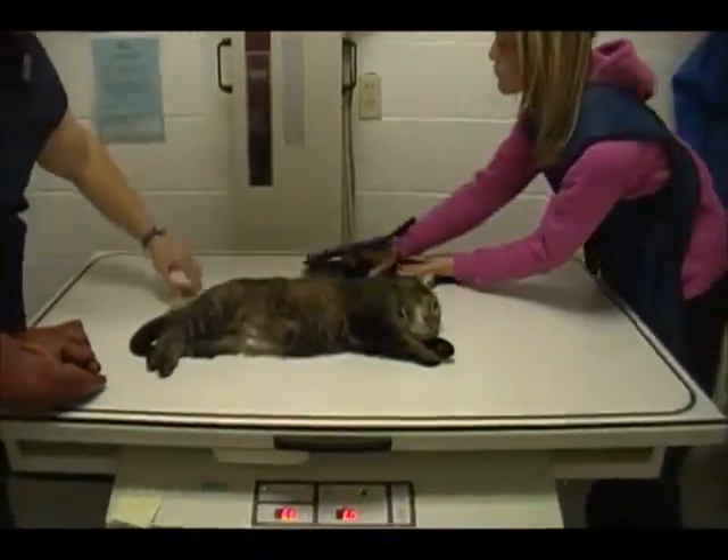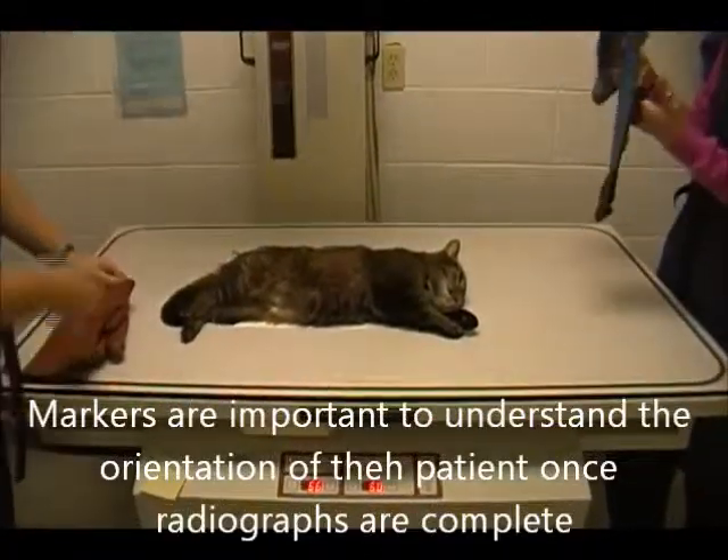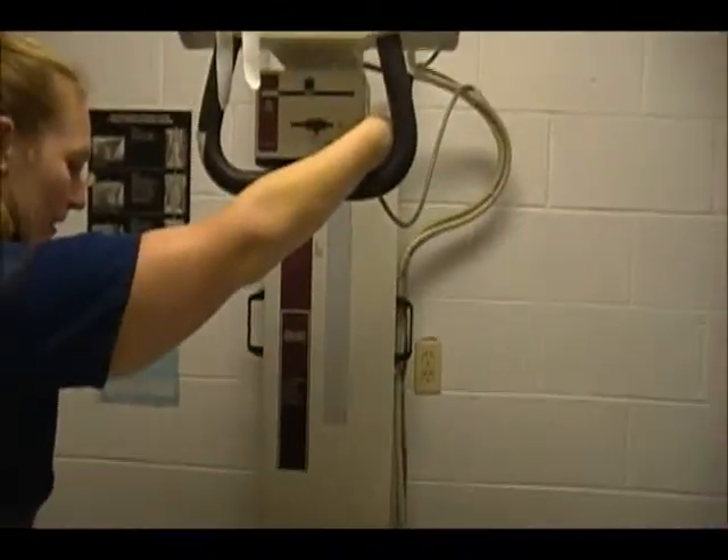Make sure we have our marker here. We're going to collimate to reduce the area and prevent scatter radiation.